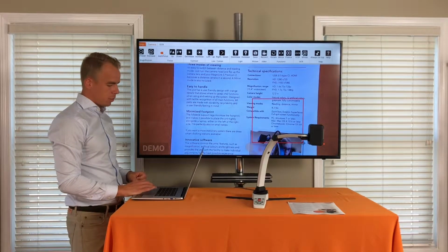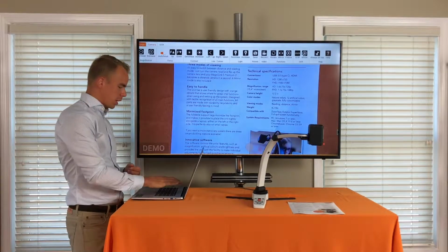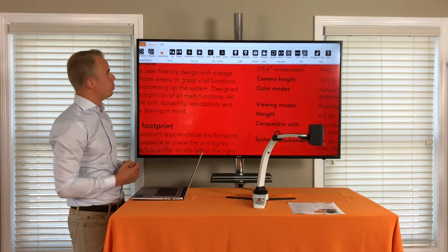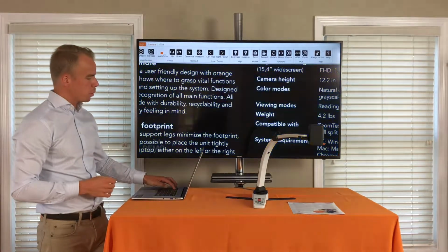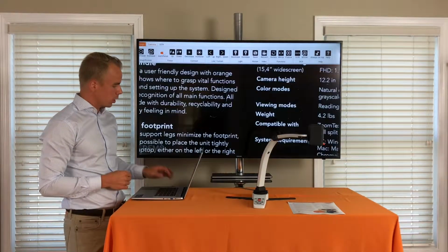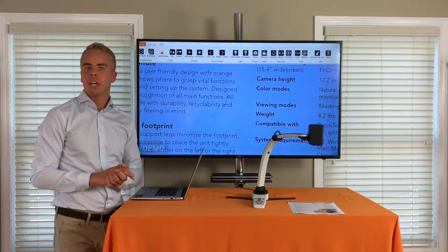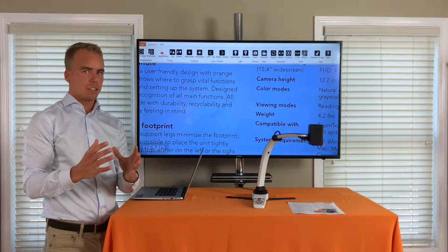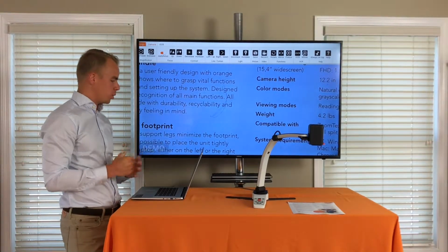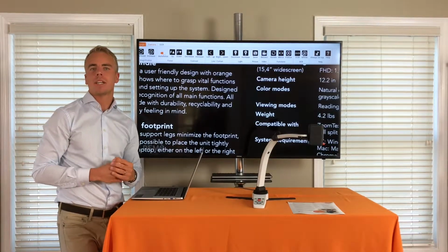Another thing is the artificial colors. I can adjust the colors to whatever my need would be. The good thing here is when I've found my favorite contrast, it's easy to go back to natural and toggle between my favorite and natural back and forth. Could be useful when I'm having, for example, text and also picture, maybe a colored diagram or colored map or something that I also need to work on. I'll go over to full color, and then when I'm continuing with the text, I go over to my contrast.